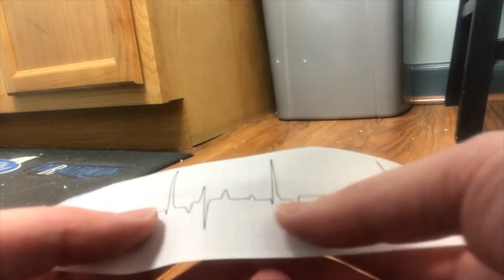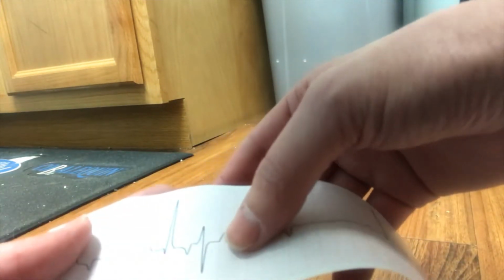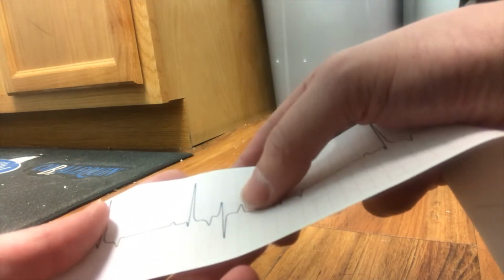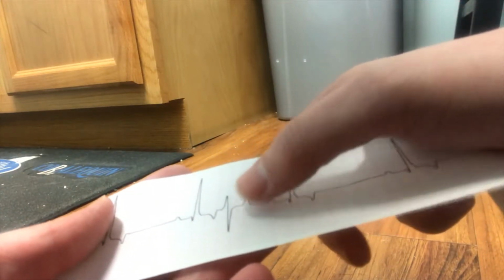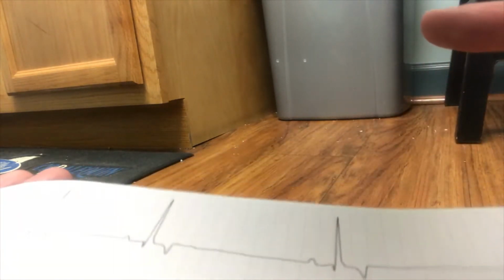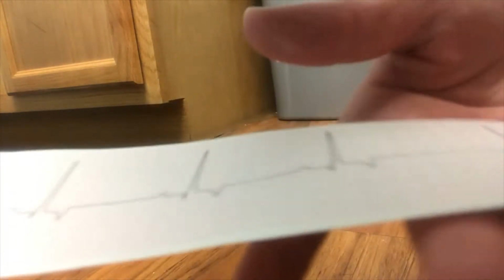Here we have our P, we have a QRS complex with a T, but then at this next one, it is reversed, as well as there is no P wave associated with this QRS. So that could be signs of a potential VPC that Lila has, which she does have a history of. Other than that one though, everything looks even.